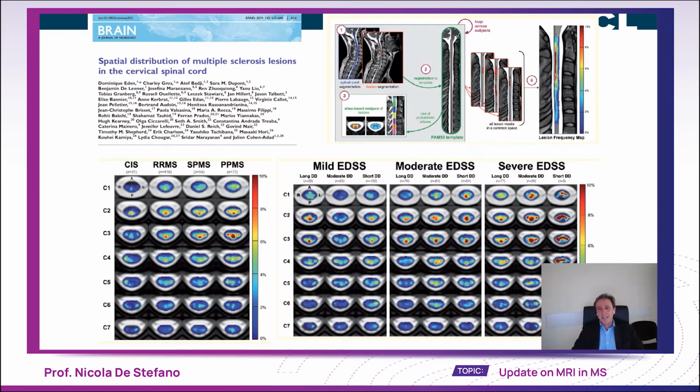Mild EDSS has much less lesion load compared to moderate EDSS, and even more lesion load is present in severe EDSS. So this is important as well.